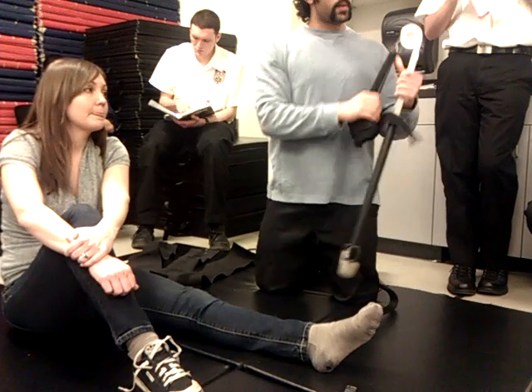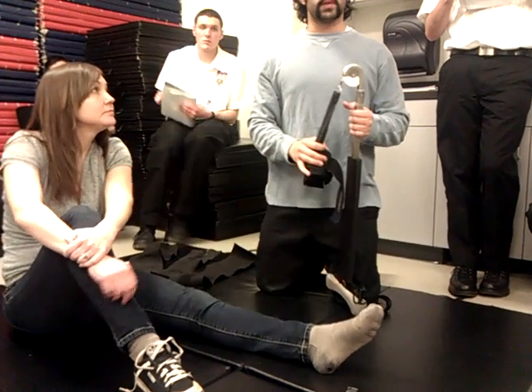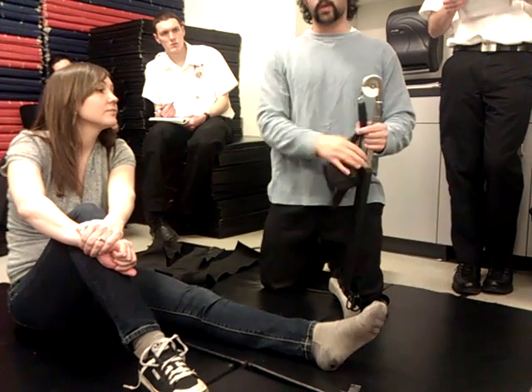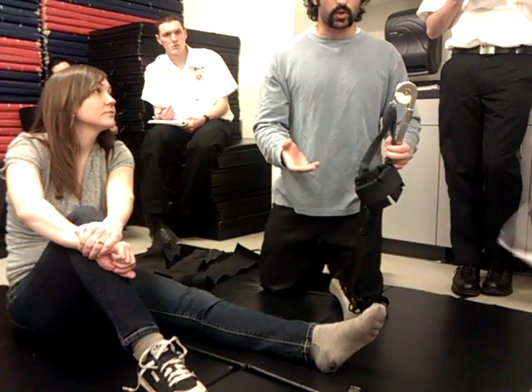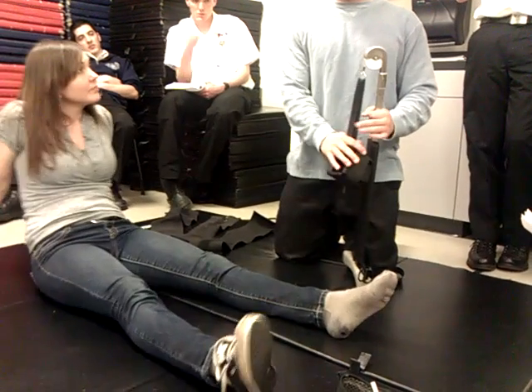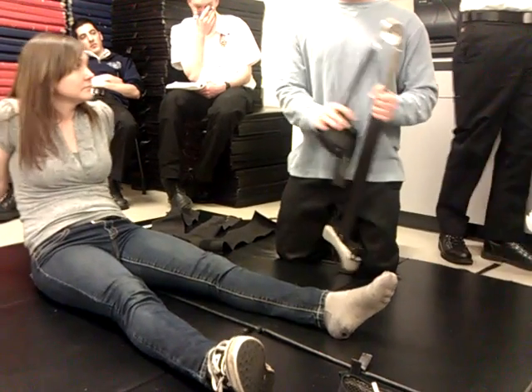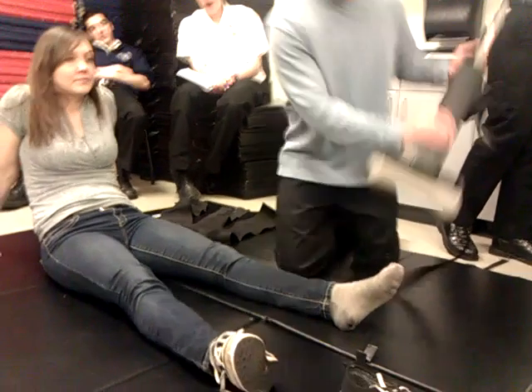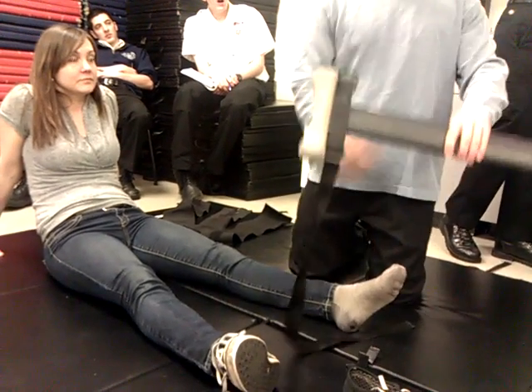On that note, I've been told that we're not pulling full traction in this class, which means that you're not pulling the full amount, you're not pulling 15 pounds, you're just pulling until it's snug, and you're going to verbalize how much traction you'd be pulling. So if I weighed 150 pounds, you'd be pulling just enough traction where there's tension on it, but you'd be verbalizing to the proctor, I'm pulling 15 pounds of traction for this particular device. Okay? So no manual traction and no measuring necessarily.